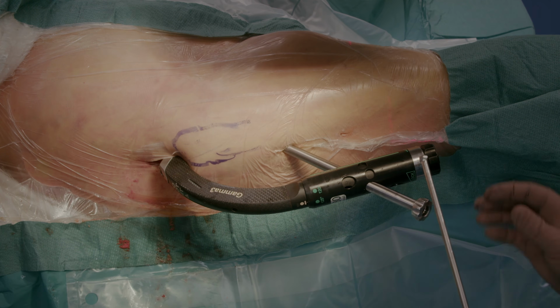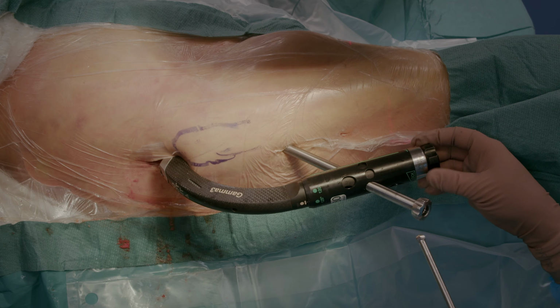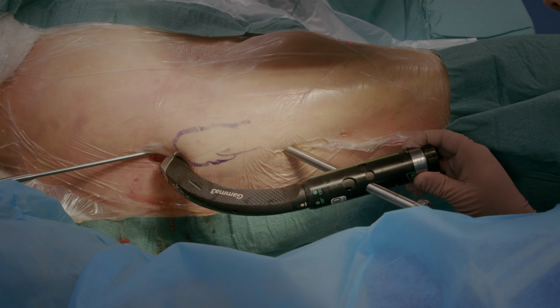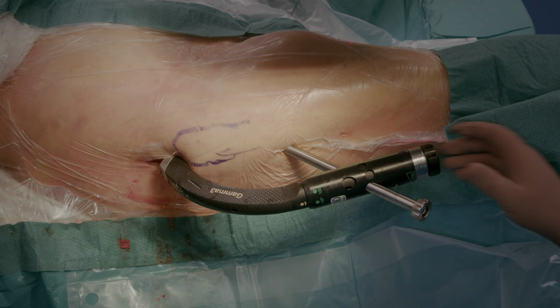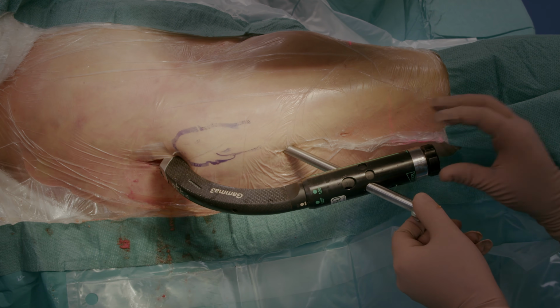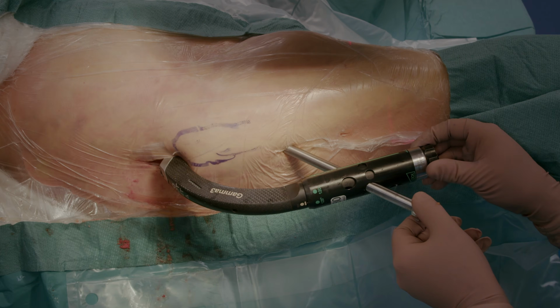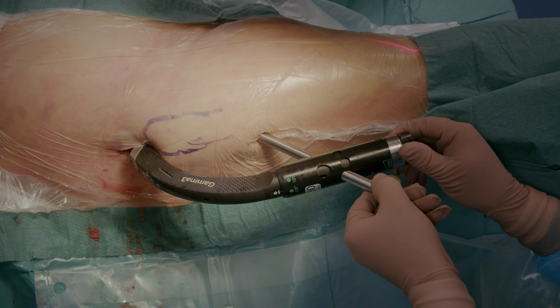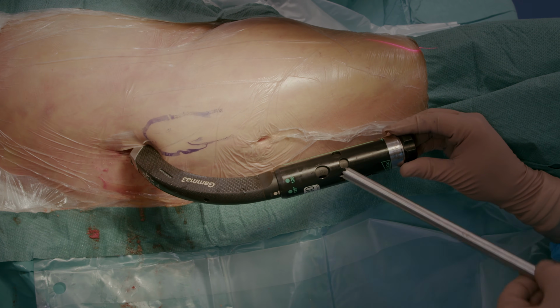Next, we place the distal locking screw into the nail. But before doing this, you need to make sure the target device is still tightly in place. Sometimes it may loosen a little when the nail is inserted to the right depth. If this happens, the target device will no longer target to the right place. Now we insert the distal locking screw by first removing this lag screw guide sleeve, which is no longer needed.